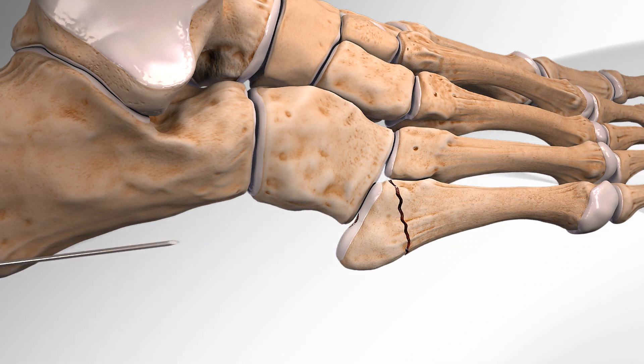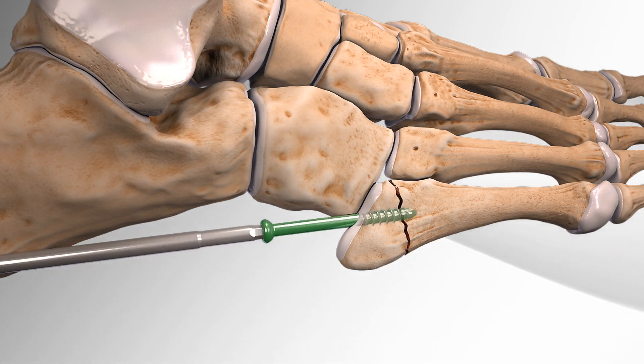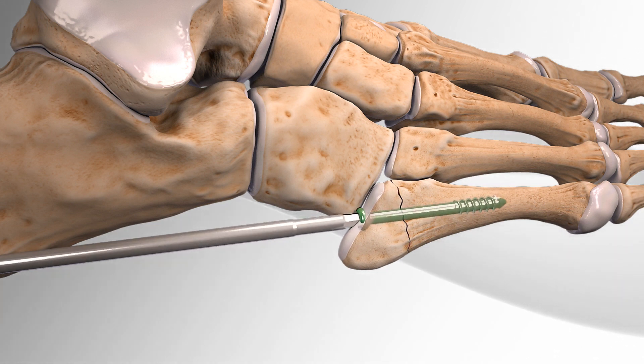Lastly, the surgeon inserts the surgical screw through the base of the bone until it is fully inside the bone, holding the broken bones in place, completing the procedure.